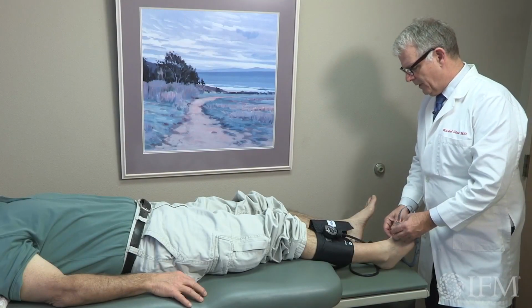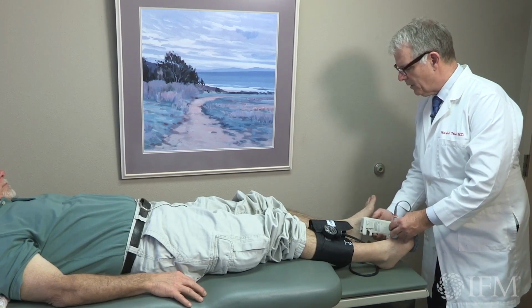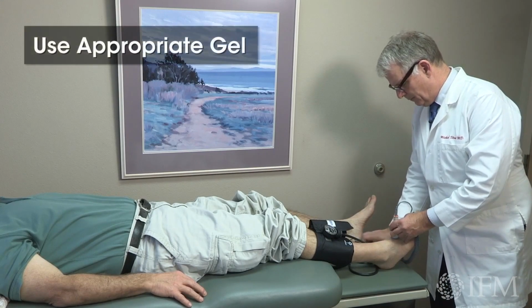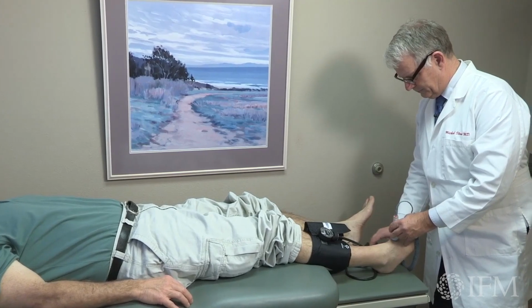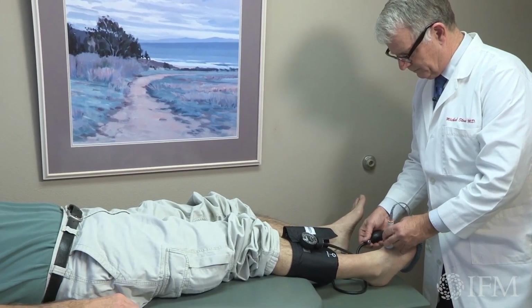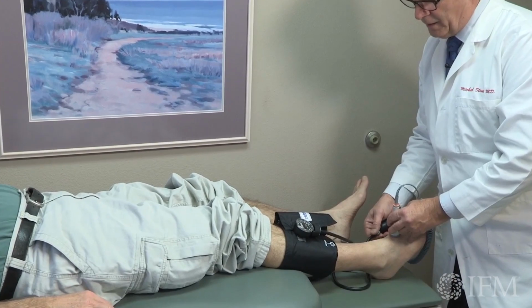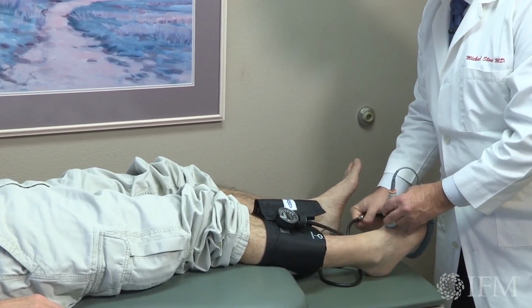So Steve, we have a little ultrasound medium on your foot, and then I'm going to pick up your Doppler pulse. There it is. You hear that? And then we're going to listen to where it goes away.